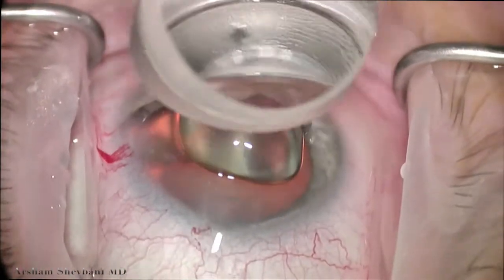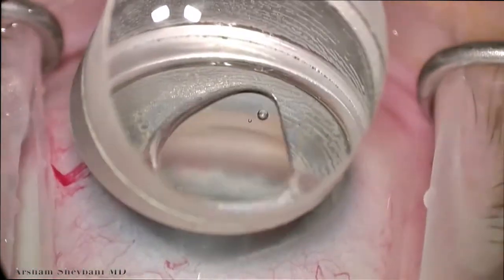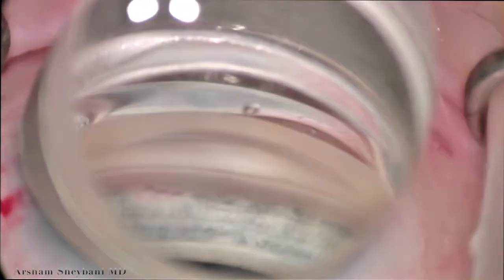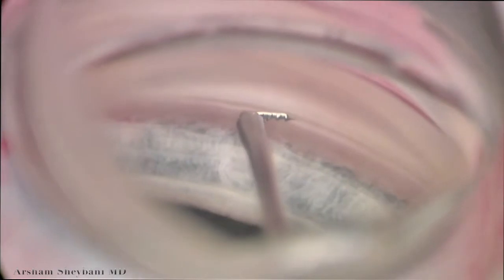We then rotate the patient's head away from us — this is Katena's disposable gonioprism. The optics are excellent with minimal glare. This is important when we want to target these eye stents because we really need to identify the tissue that we're placing the stent in, and this video is excellent in demonstrating that.